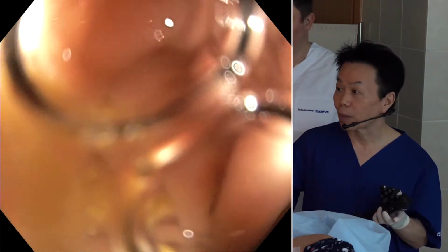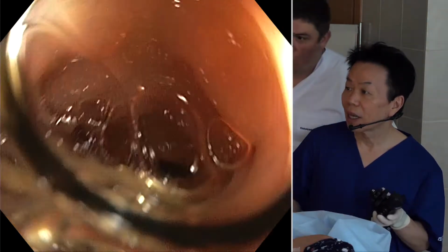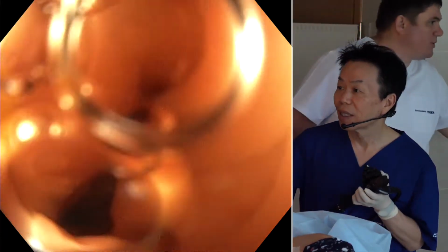And so maybe they haven't injected the Buscopan in this case. So the colon looks a little bit spastic. You can't identify the lumen very well, but I'm trying not to inflate too much CO2. We can make the injection of Buscopan if you want to. Oh, yes, I think that would be better to inject. A small amount is enough.